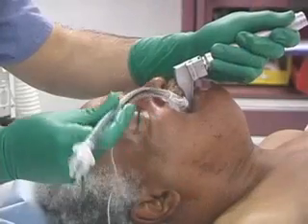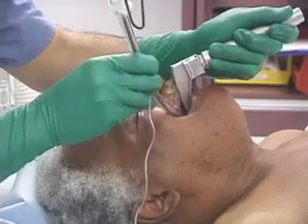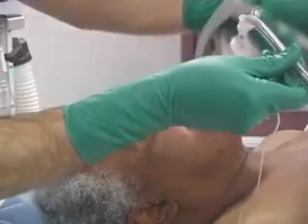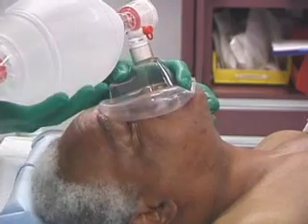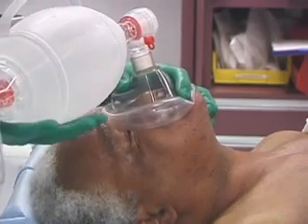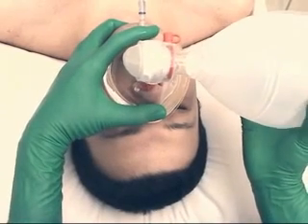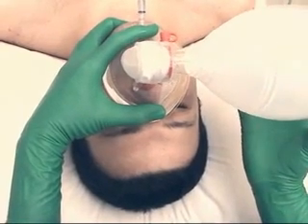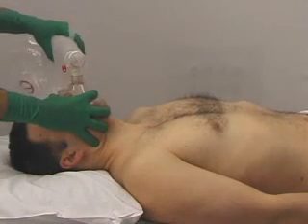While endotracheal intubation is frequently the definitive airway management approach for patients in respiratory failure, it is not always feasible. In these circumstances, ventilating a patient with a face mask can be an invaluable temporizing measure. The purpose of this video is to demonstrate the equipment and technique used to provide positive pressure ventilation with a face mask and a bag valve device.